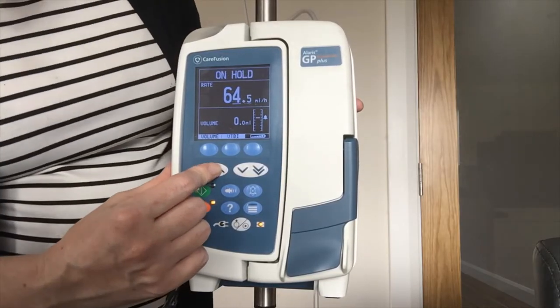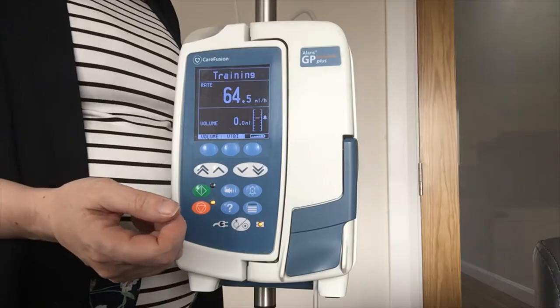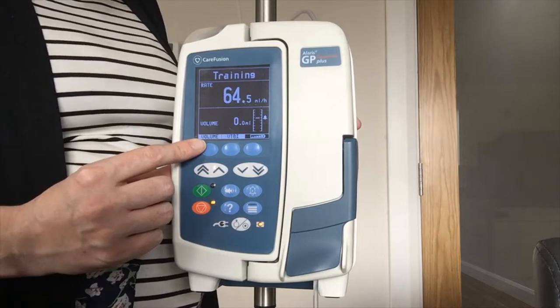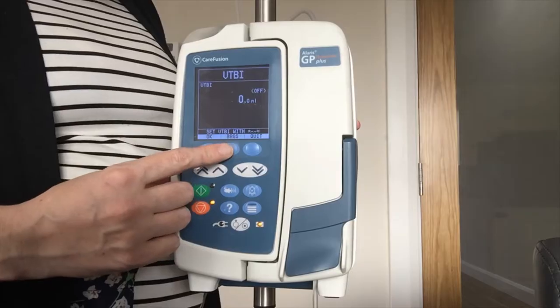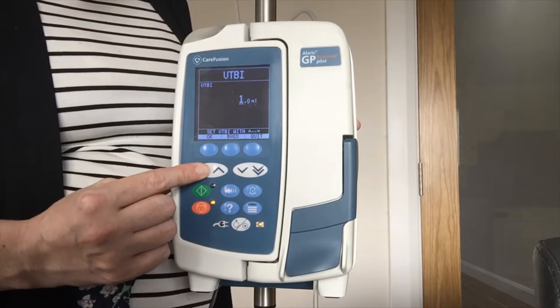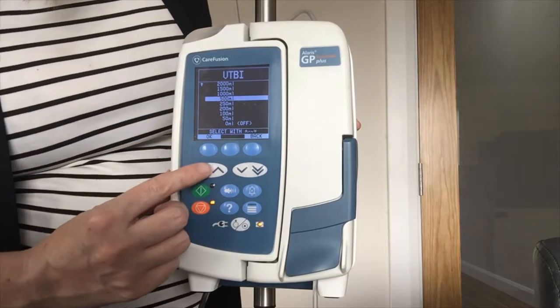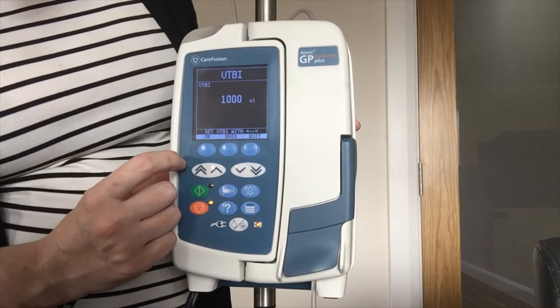So that is my rate set at 64.5, and the next thing I need is my bag volume because the pump needs to know when to stop. On screen I have two volumes: my volume infused — which records my 24-hour fluid balance — and next to it my volume to be infused, VTBI. I will hit my VTBI. There is a lovely feature where it shows bags, so I will press bags and there is a full list. For example if I was using a litre I would highlight the litre, giving me 1000 ml, and press OK.